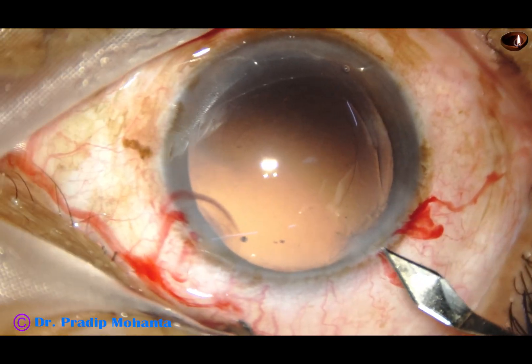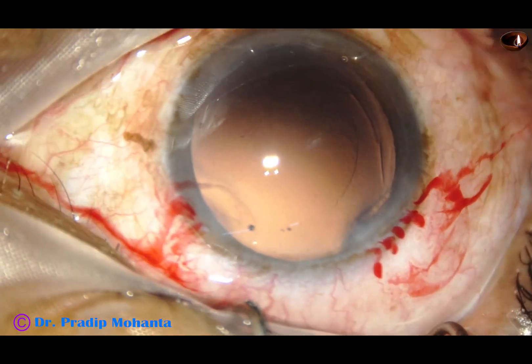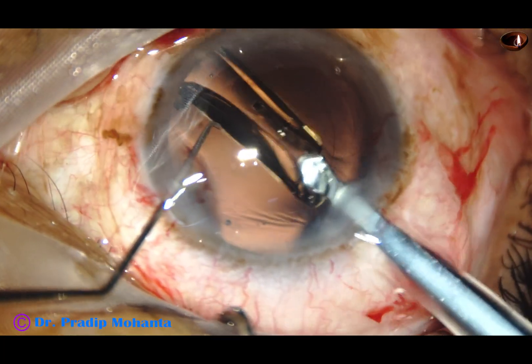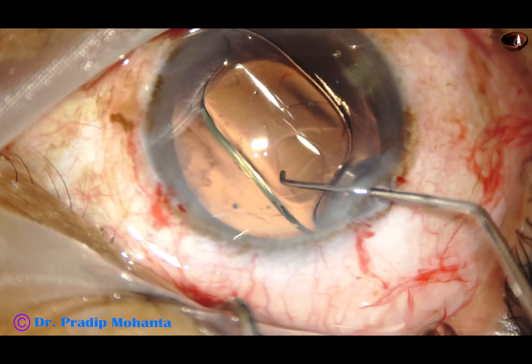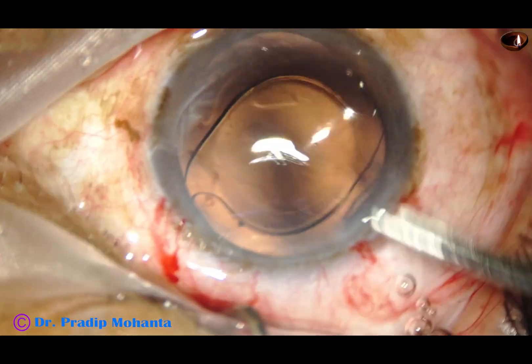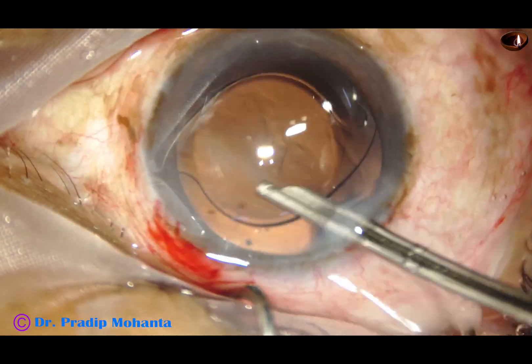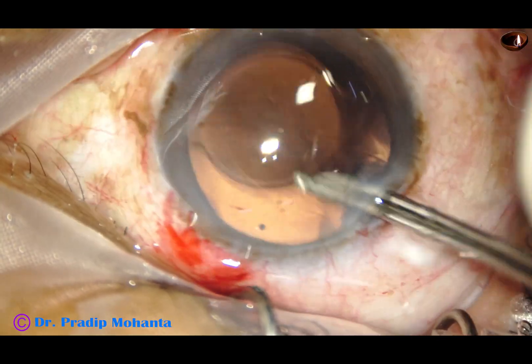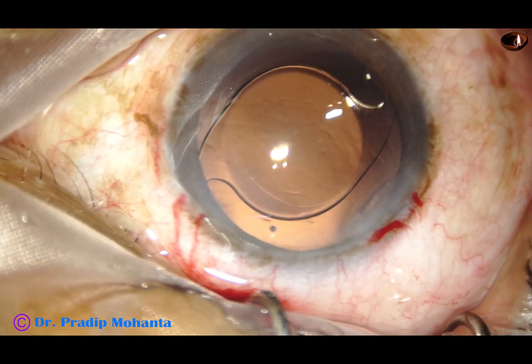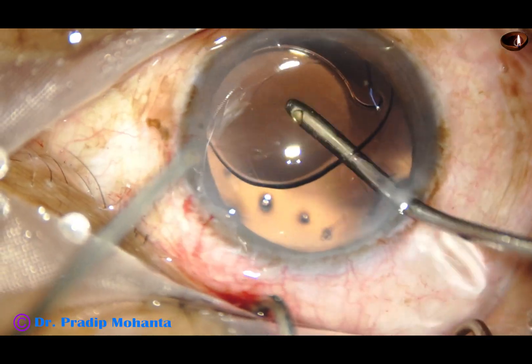In this video, we have seen the hand movements of the nuclear sustainer and pre-chopper very well. Let me describe: the nuclear sustainer goes in at a slant, stands vertically, and then you pronate your hand more so that it turns to the equator — the ball turns to the equator. Scratch the surface of the nucleus, go under the rhexis margin, and hook the equator. You can rotate the nucleus just one clock hour to check if you have hooked it nicely, and now stay there rock steady. Introduce your pre-chopper through the main wound, go to the center, come back near the rhexis margin, and embed into the soft part of the nucleus. Both instruments stand vertically and move to each other, performing the lateral separation.